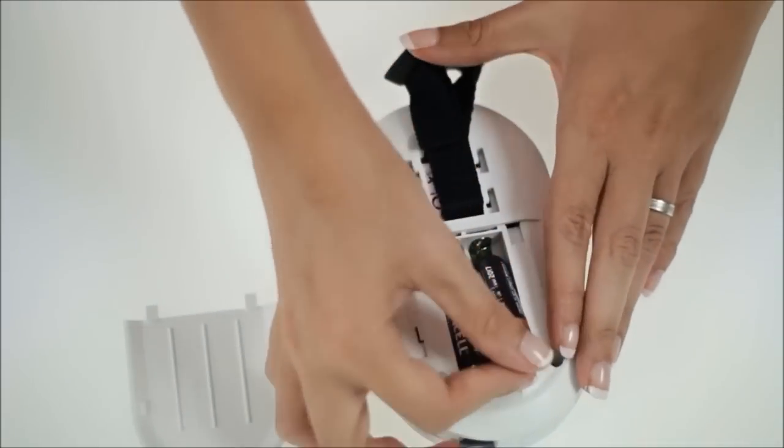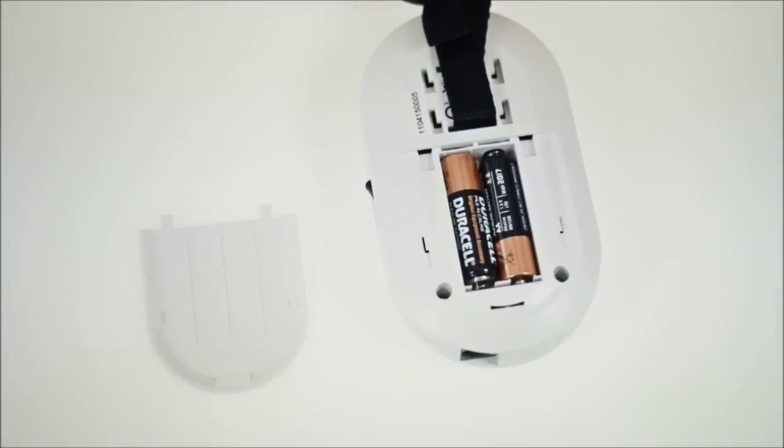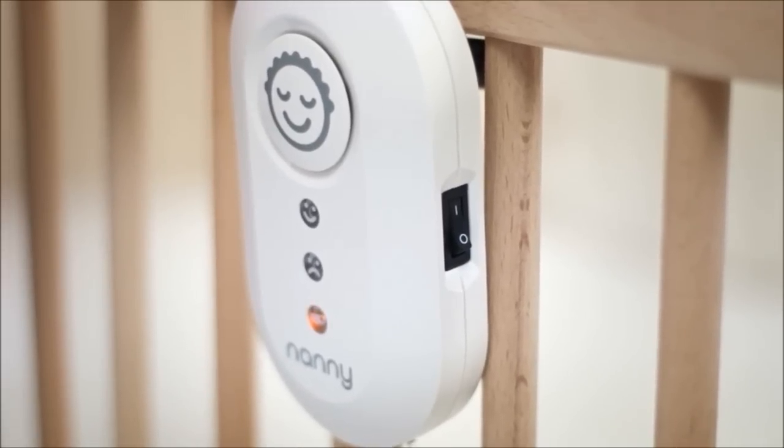You do not need to monitor battery usage, as Nanny will warn you in time with the orange LED if the batteries are low and in need of changing.